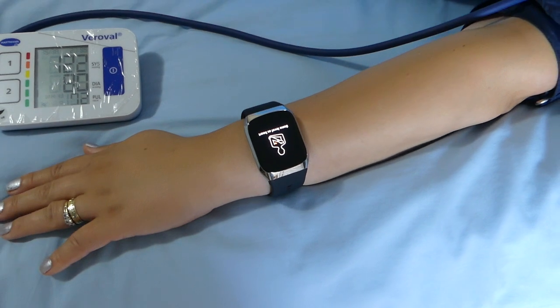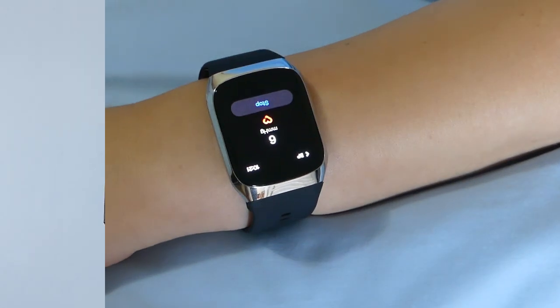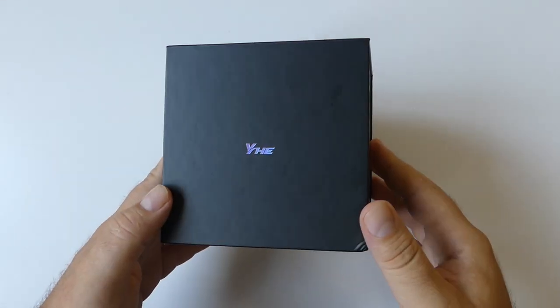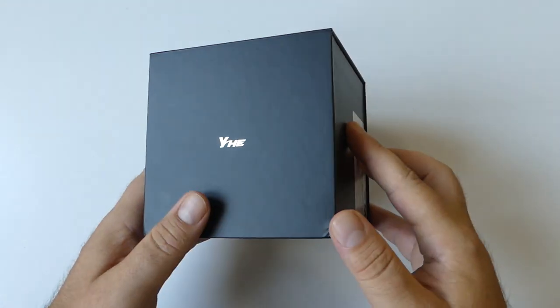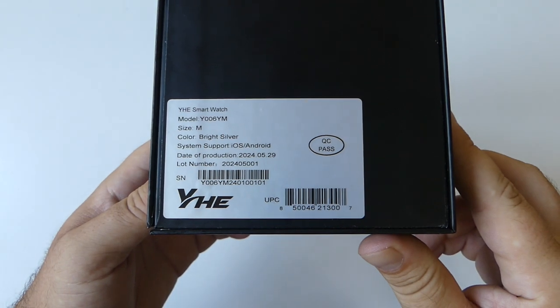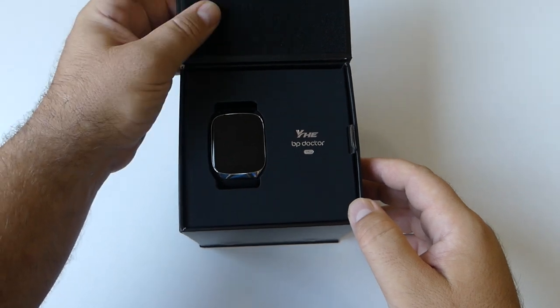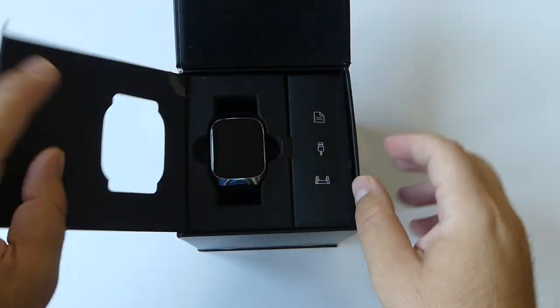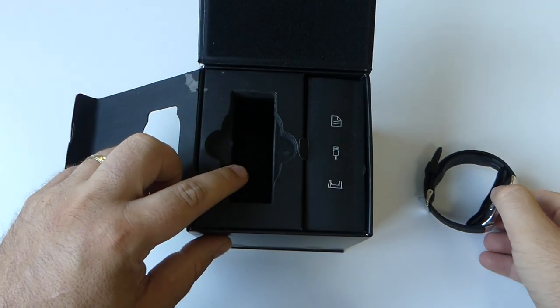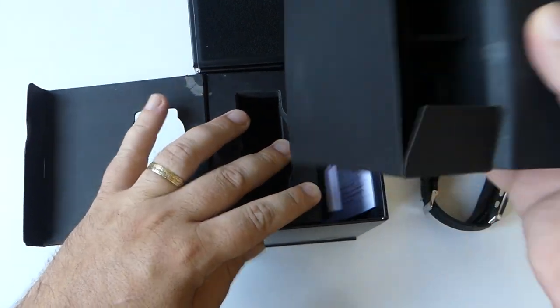Let's do a quick unboxing. The watch is well protected by a black cube box with a glossy finish on the top. You can find the brand name, and on the side the model of the watch, the size, color, and other specifications. Inside, the watch is well protected by another box, and on the side you'll find a small box including the USB charger.